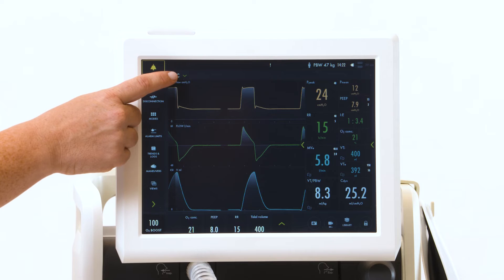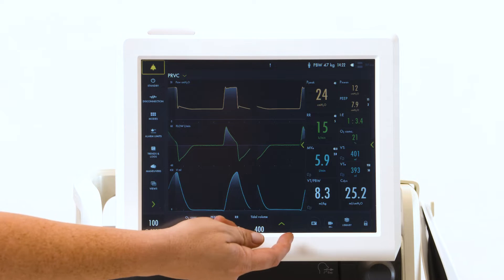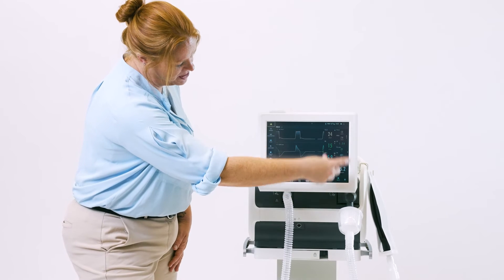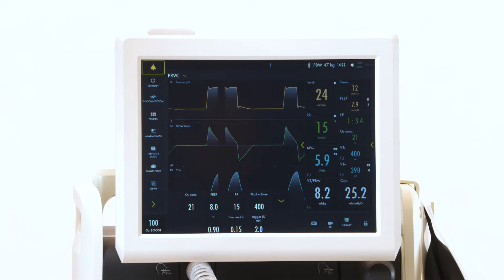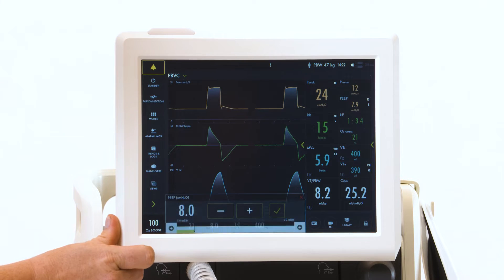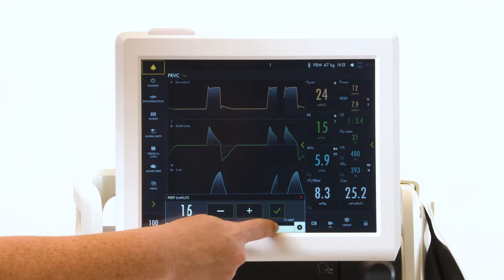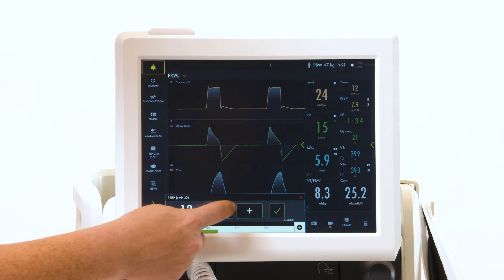Your patient mode is up here, with your settings at the bottom. On the right are your measured values. Touch the arrow to open up your advanced settings. Touch a setting. To make changes, you can slide along the bar or add and subtract.